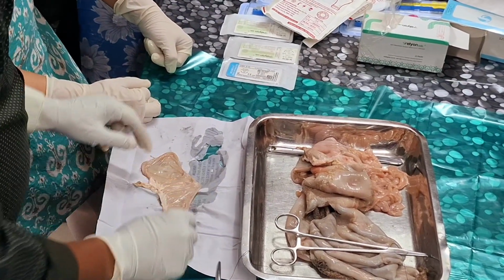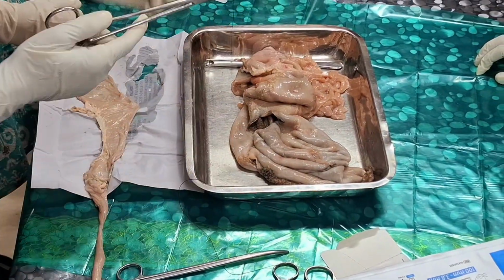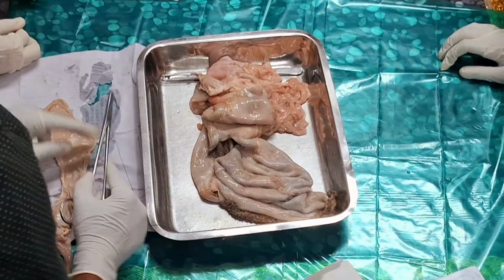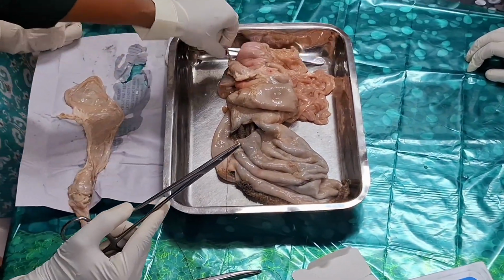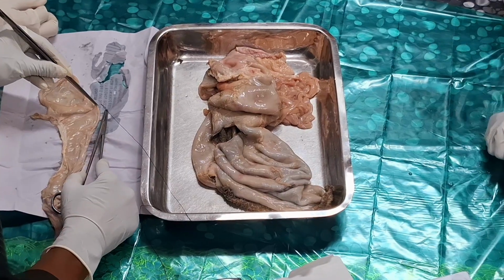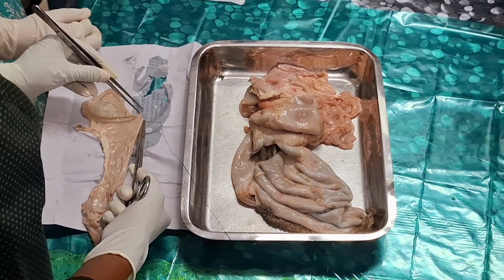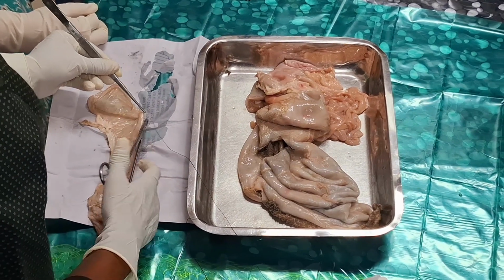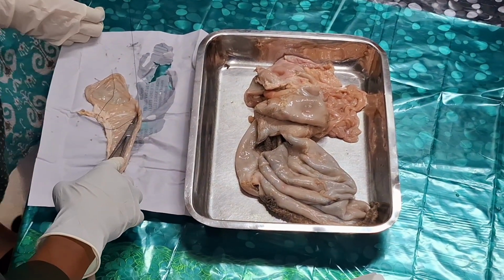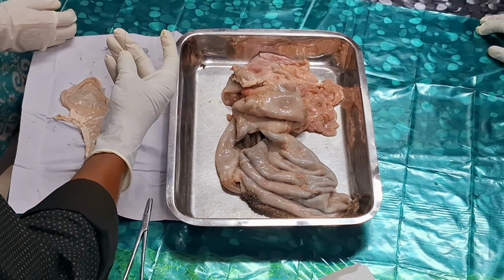Then you have to take stay sutures, as I told you. Stay sutures, about 5 millimeters away from the actual sutures. We'll apply them on all the sutures.